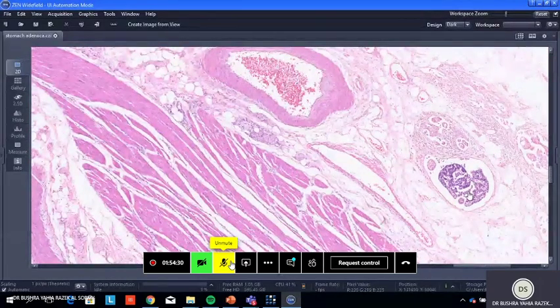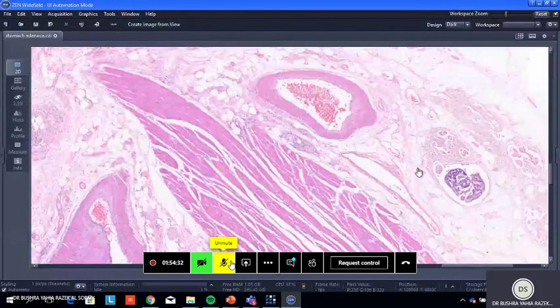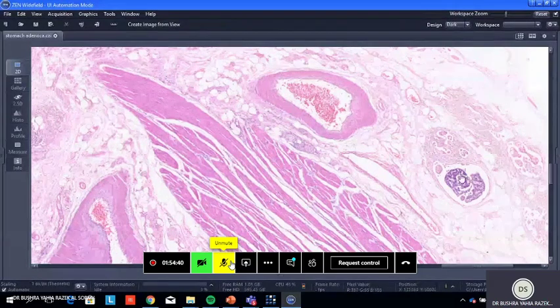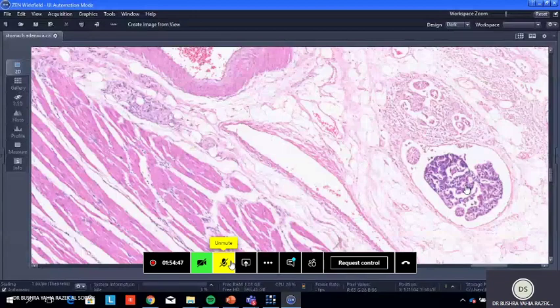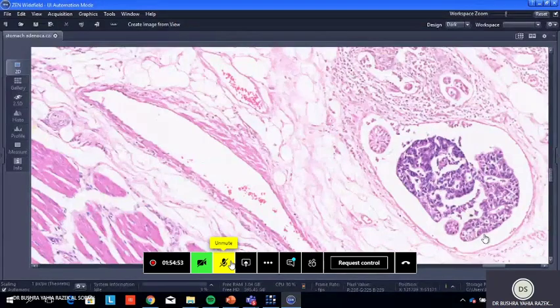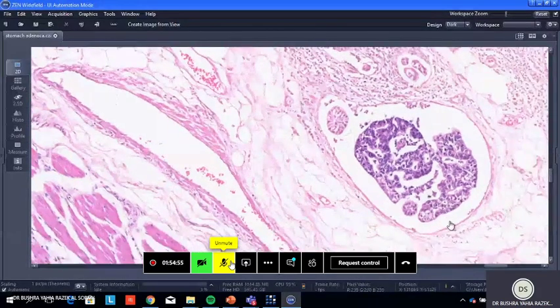Okay. How is the prognosis of this patient? Is it good or bad? Bad, because he has lymphatic channel metastasis, or emboli. We call this an embolus of malignant cells, or tumor emboli, or tumor thrombus.